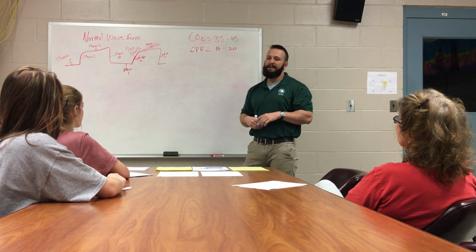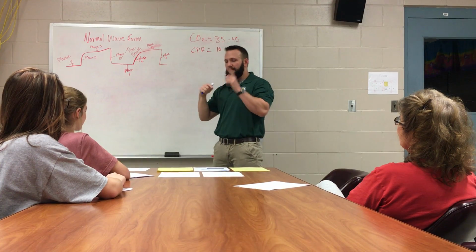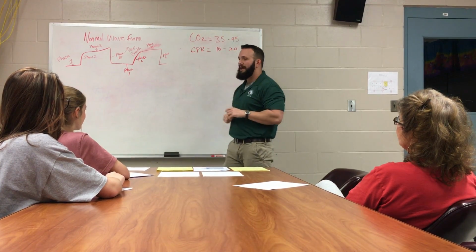Another way that we can do that is when you're intubated and we have an ET tube. So there's the tube that's in your throat, a little plastic clip clips on top of that. A little hose runs to a monitor and it'll give us a waveform.